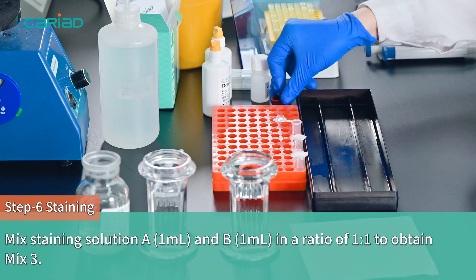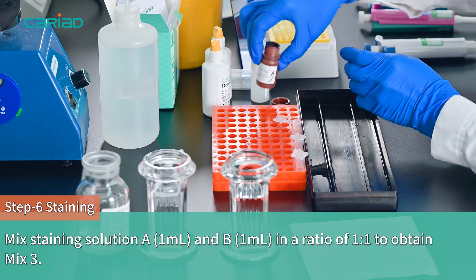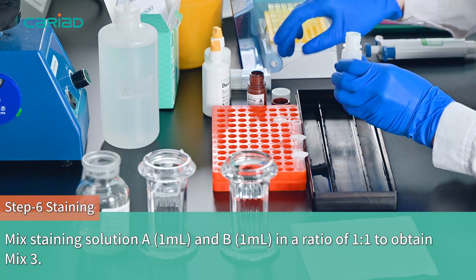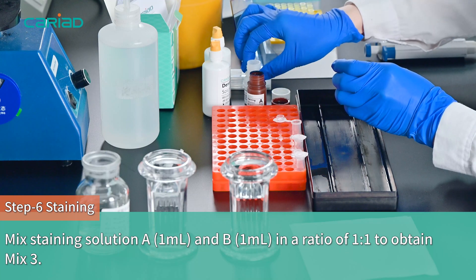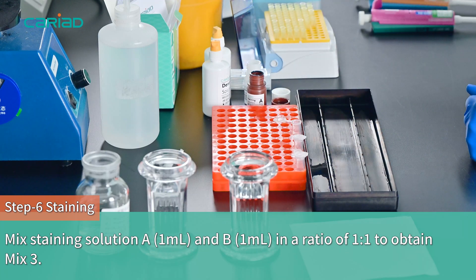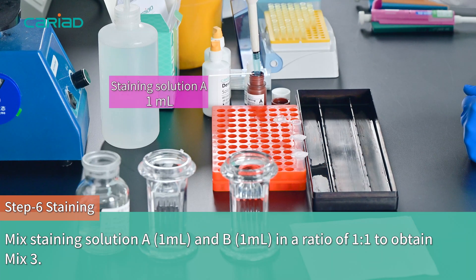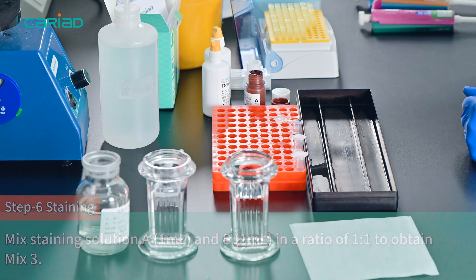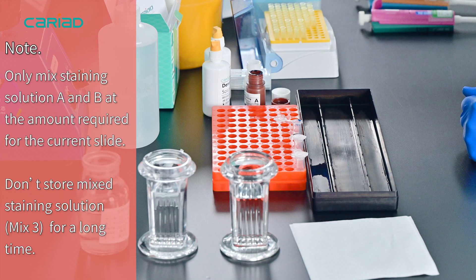Step 6 - Staining. Mix staining solution A 1 milliliter and B 1 milliliter in a ratio of 1 to 1 to obtain Mix 3. Note: only mix staining solutions A and B at the amount required for the current slide. Do not store the mixed staining solution for a long time.